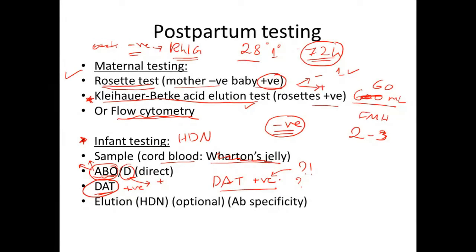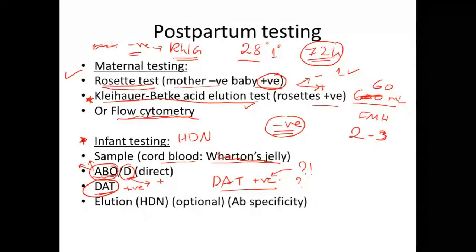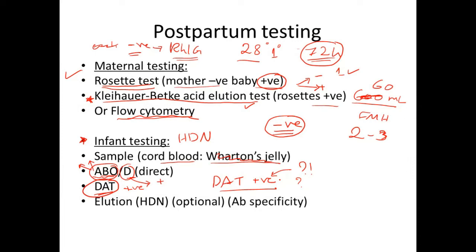Sometimes the mother may have a number of antibodies. Sometimes the serum is not available. And in some conditions the physician may ask to know the specificity of the antibody from the baby's blood.